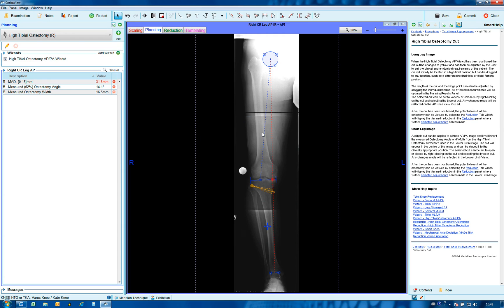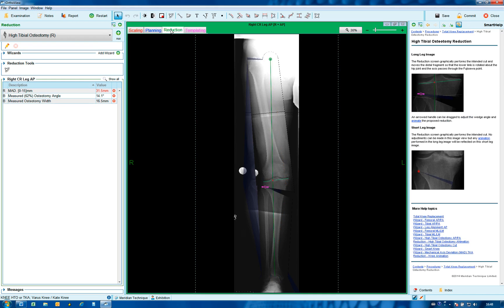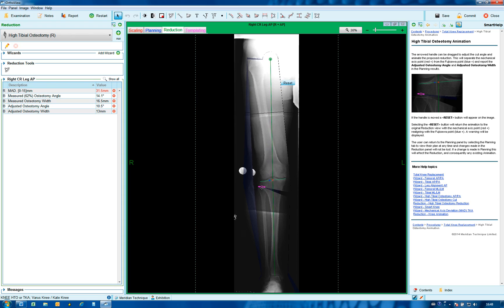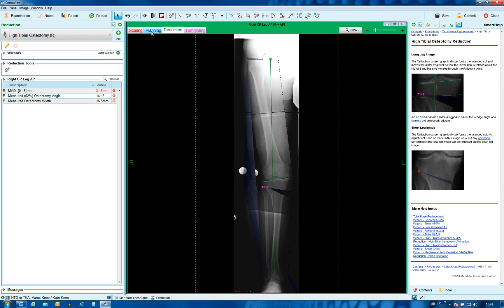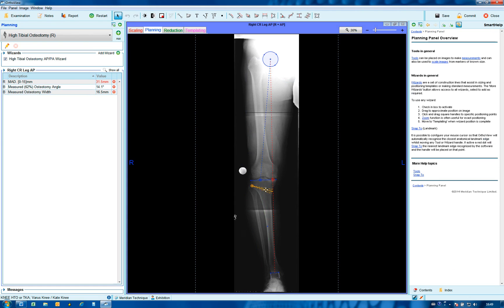Remove the magnifier and move to reduction. The already suggested size and width is shown automatically, and a cut is made to the 62% point. This can be adjusted using the pink handle if a more neutral position is needed, and the adjusted value is shown. Reset is also possible.